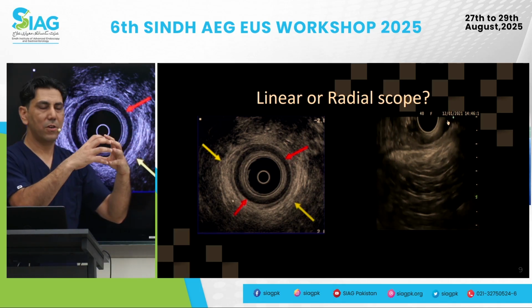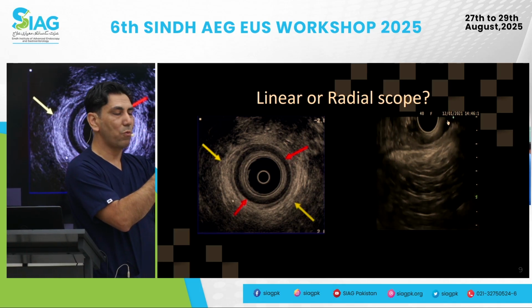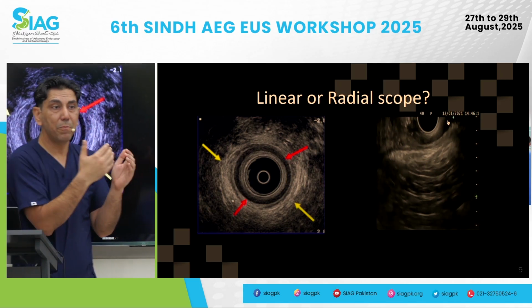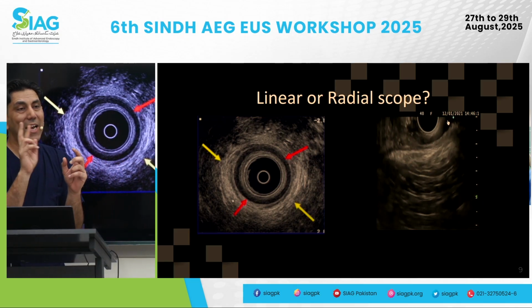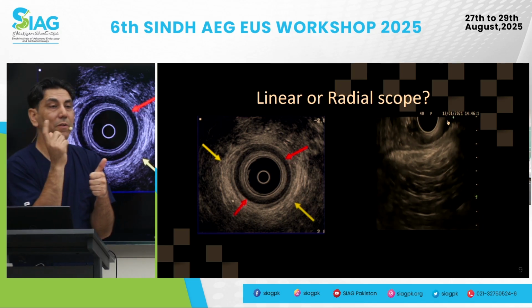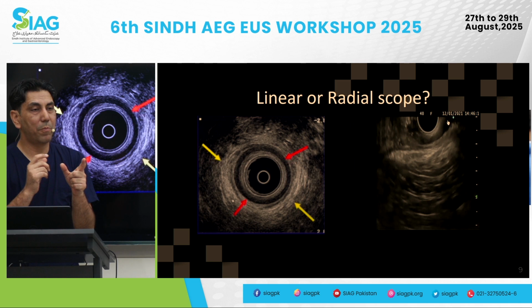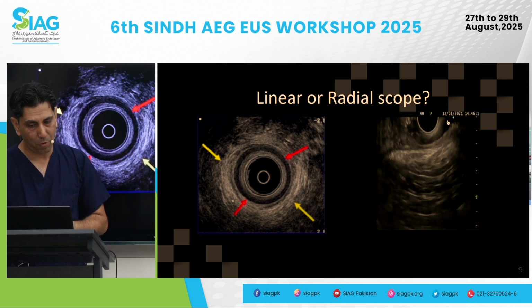So there's a coupling of interface of the probe or the balloon with the mucosa, and then we've got the mucosa, submucosa, and then in that we've got a muscularis mucosae. So 2 black layers is your muscularis mucosae. Behind the bright layer of the submucosa, then we've got the muscularis propria, which is also going to appear black. So 2 black layers, muscularis mucosa and muscularis propria.